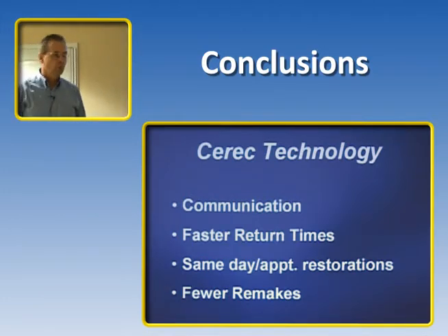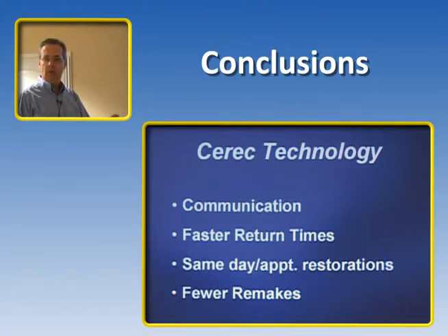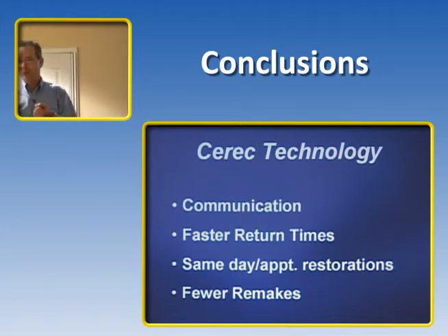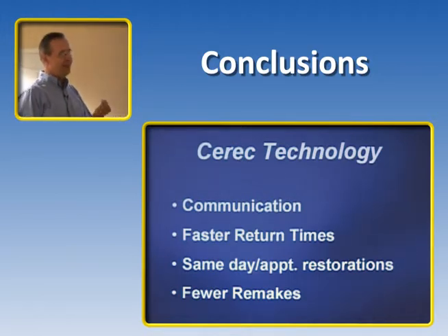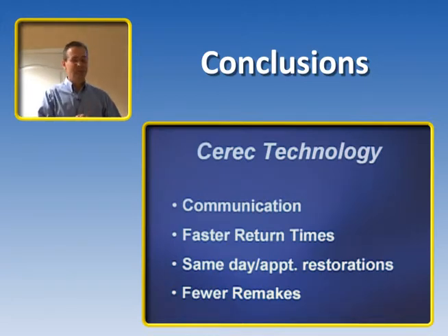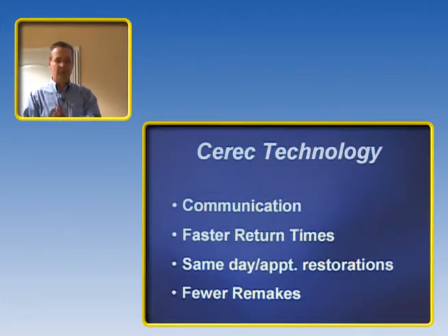By reviewing a digital image, that's a positive image and not a negative image like an impression, we get so much crisper a look at what is actually happening. We've all looked at impressions and you can say it looks good, but really it's amazing that you get impressions to work. We're taking a liquid, turning it into a solid, then we're going to pour a liquid into it, turn it into a solid, and expect that through all those changes, everything's going to stay exact.